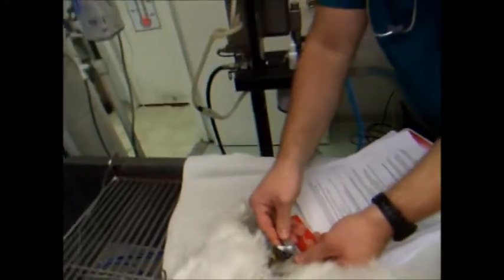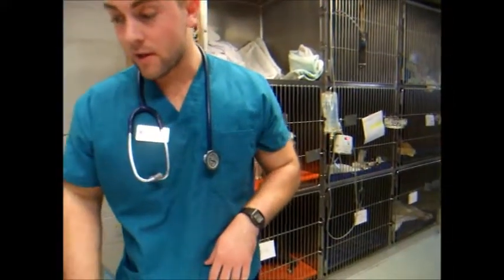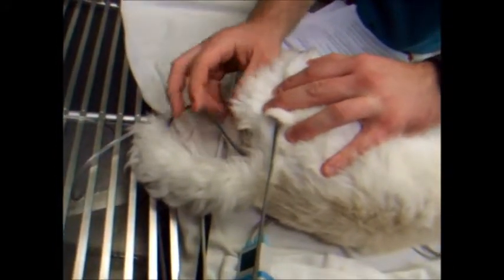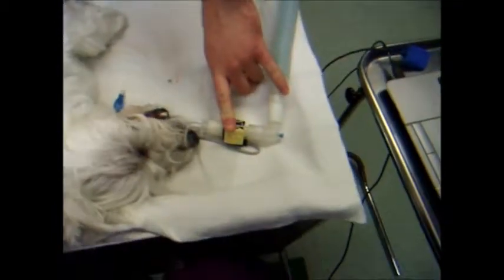We do not have an esophageal stethoscope, which would go into the throat. It would measure the heart rate internally. We also have our thermometer here, which is in his butt. And let's see, this also measures the respiratory rate.